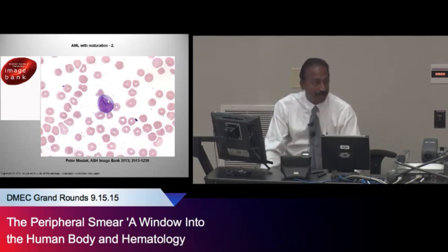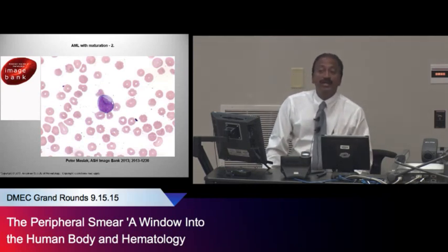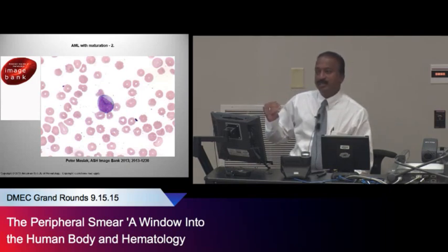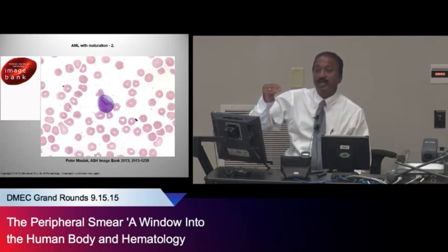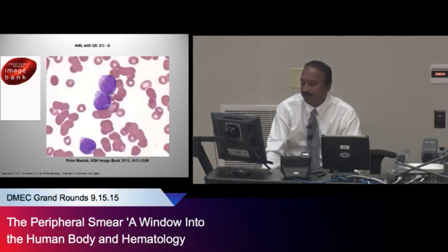We'll see a lot of MDS patients with a lot of large myeloid cells, but that cytoplasm is agranular. There's no granularity to that cytoplasm. As you get more mature to promyelocytes, metamyelocytes, and myelocytes, the cytoplasm develops granularity. So when I see a very hyaline, smooth cytoplasm, that worries me. That's a very early immature cell and a blast. That's more of a blast from a patient with AML.